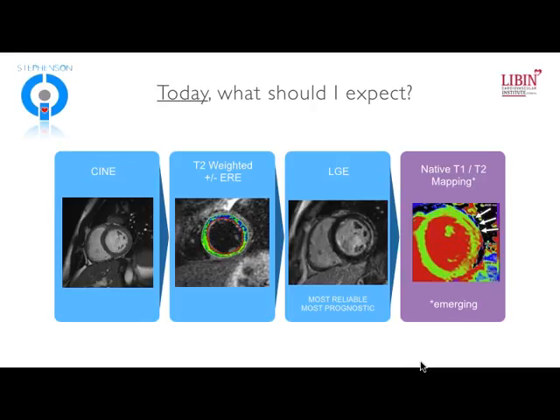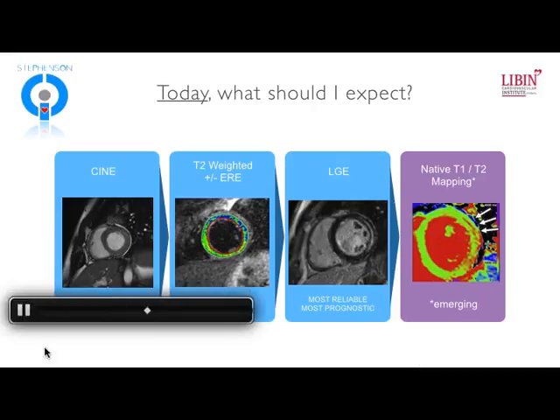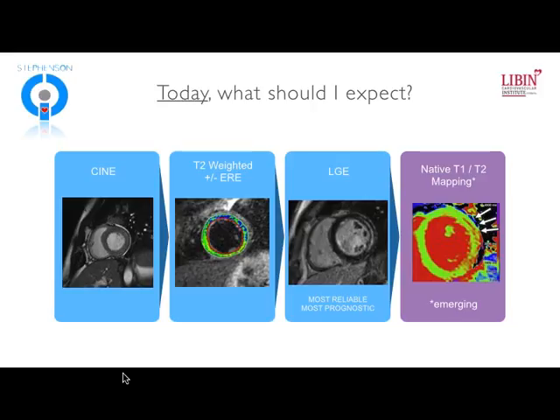And so we've talked about some things on the horizon, but today, in 2015, what should we expect when we order a cardiac MRI? We definitely are going to expect cine imaging. There's no doubt about that. And so the capacity to get accurate prescription and analysis of both left ventricular volumes, function, mass, and wall thickness is certainly there, and obviously to look for any pericardial effusion. That's going to be at the core of any imaging study.